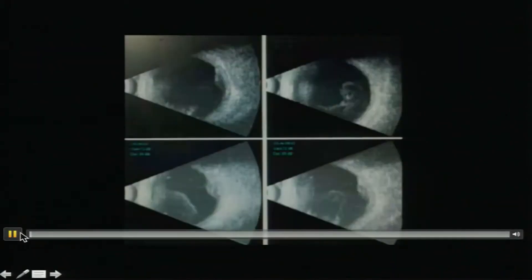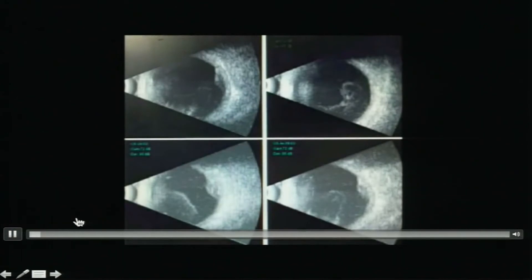This is another case — not exactly subretinal heme, but an organized membrane under the macula with vitreous hemorrhage. After vitrectomy you can see the membrane; laser had already been performed. We induce detachment by injecting balanced salt solution via the silicone oil injector in all four coordinates, and after a fluid-air exchange the blebs unite to form a nice detachment.